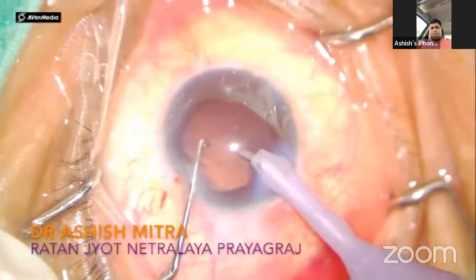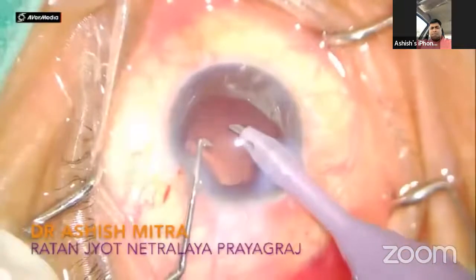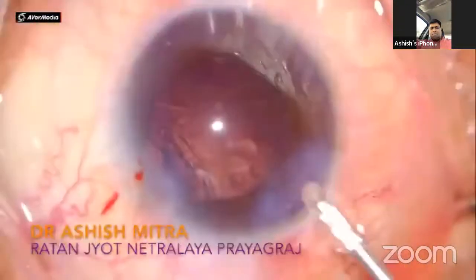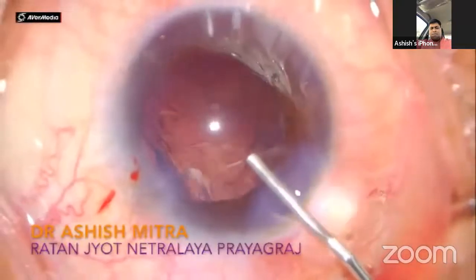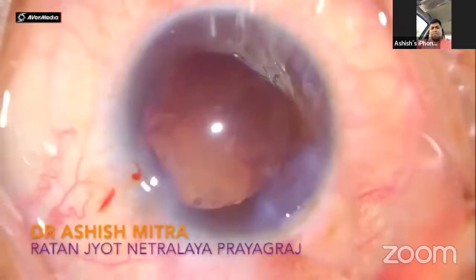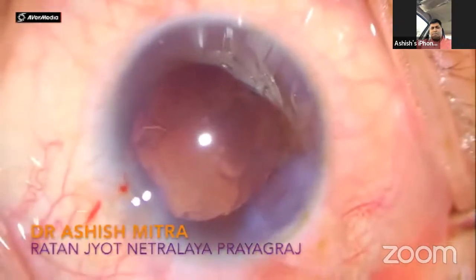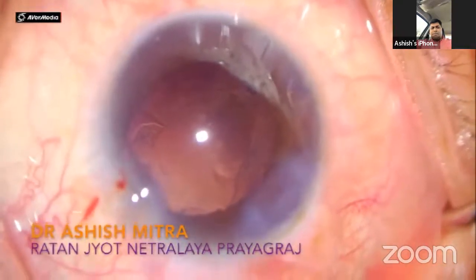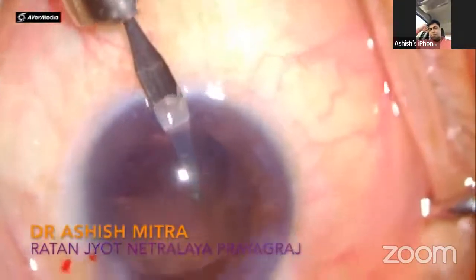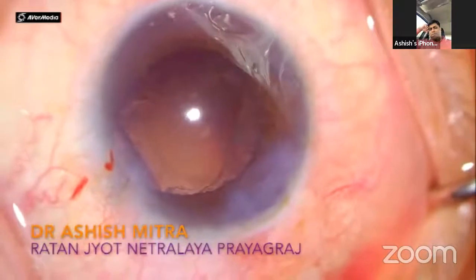Now after completing the emulsification of the nucleus, just see there is a blood clot at the side port. I will be telling its significance later in the video. At this point of time, I noticed that there is some laxity in the bag. There is zonular dialysis present. So after injecting Visco, I decided to put a CTR.